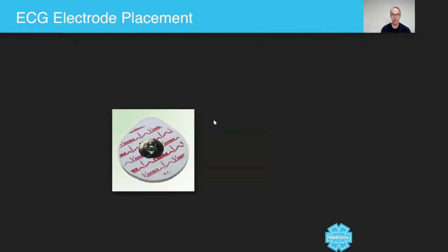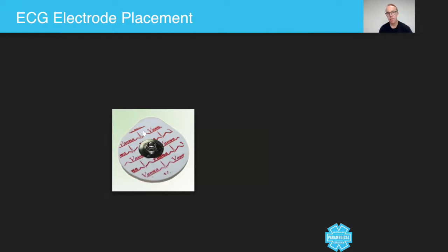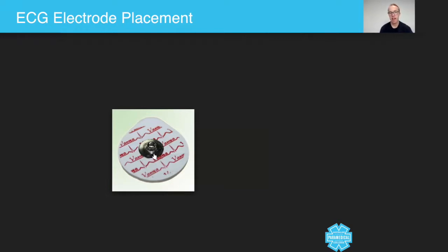Now here we have on the screen a typical ECG electrode. You have this soft pad and underneath this soft pad is a type of gel that allows conduction of electricity to be read. Now this silver part is the part that connects to the leads, so the ECG leads.